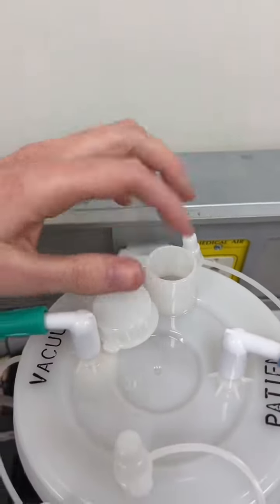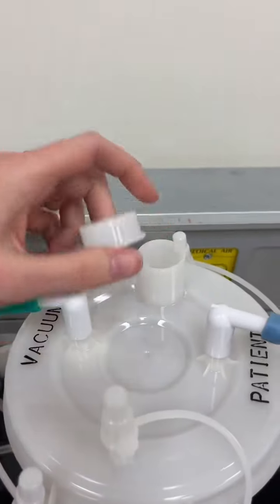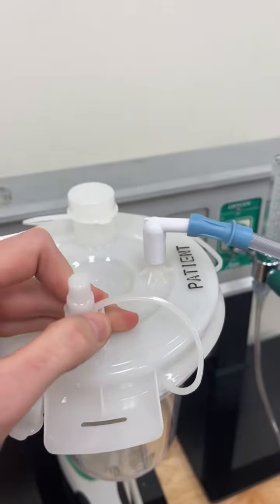Now what you'd use this one for is when the canister is full of secretions, you pour something through here to solidify it so you can throw it away. Then it's labeled ortho. I don't know. I've been a nurse 10 years, never used it.